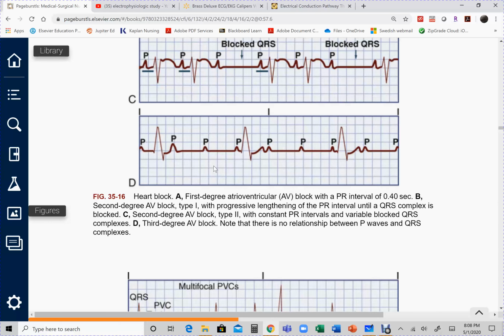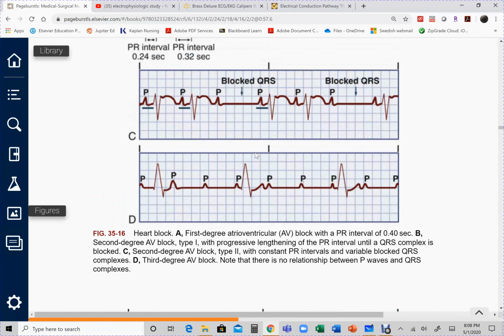And likewise, if I measure the intervals between the R waves, they're also pretty regular, although I only have 3 to compare, but they are regular nonetheless. So this proves that they are not talking to each other. Each one is generating its own impulses. It's like the AV node saying, I don't know what you're doing, man, but since you're not sending me signals, I'll generate my own signals.